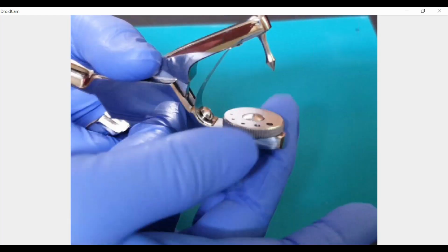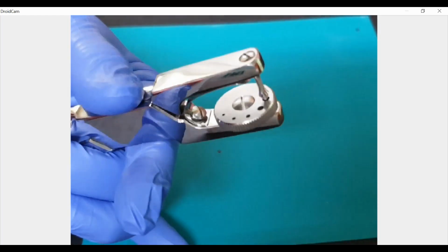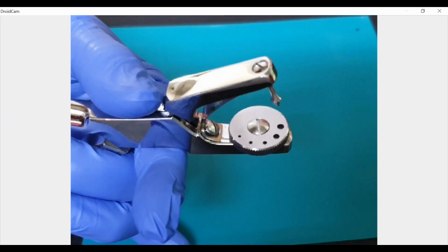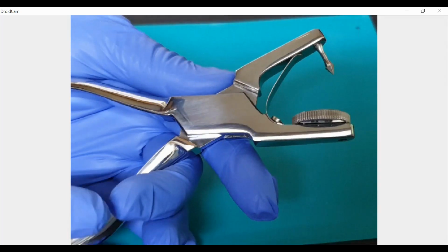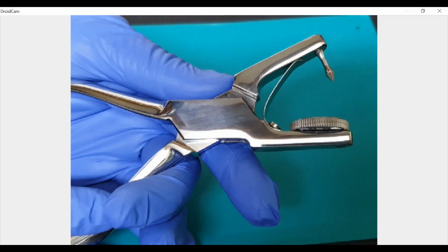And it's very important for us to have a crisp, clean punch at every step of our isolation, be it single tooth isolation or multi-teeth isolation. It is also important to follow the manufacturer's instructions and autoclave even the punch frequently as specified.